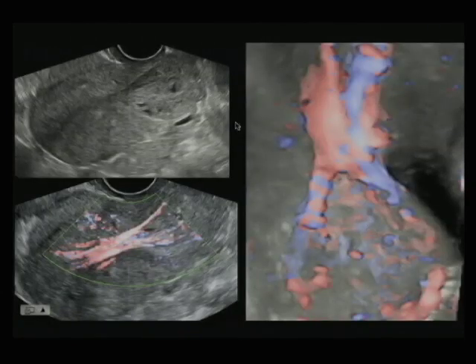Now this patient, on the other hand, had a very large, what appeared to be a polyp that was protruding from the cervix. Here's the top of the uterus over here, and you can see that this polyp is just poking its way through the cervix.